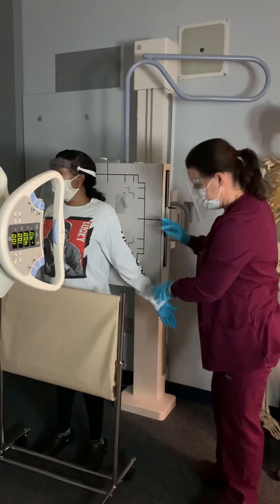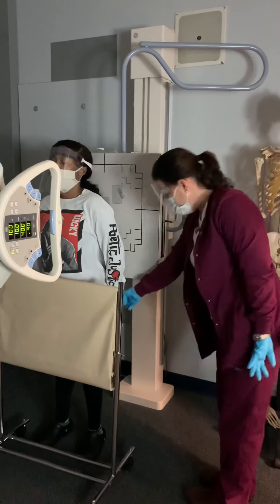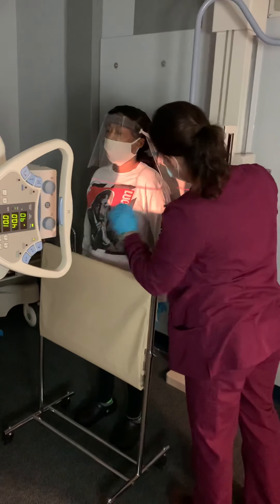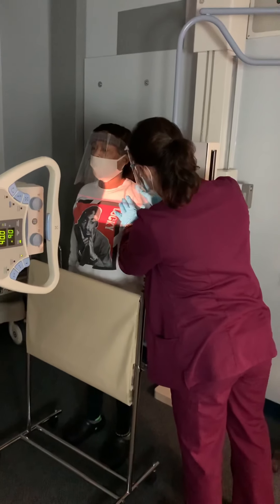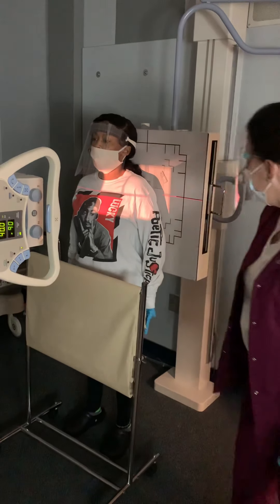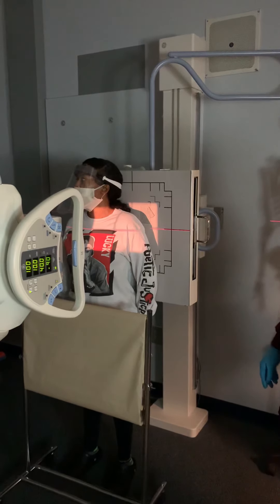Keep everything the same. Take your hand and put the back of your hand up against your side — just like that. So the back of her hand is right up against her side. I want to keep her shoulder relaxed. Make sure I'm still one inch below the coracoid, and make sure she's not rotated at all. Hold just like that. Look away for me. Hold your breath, don't breathe, don't move. Beep. You can breathe and relax.